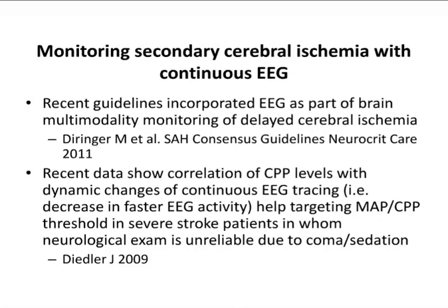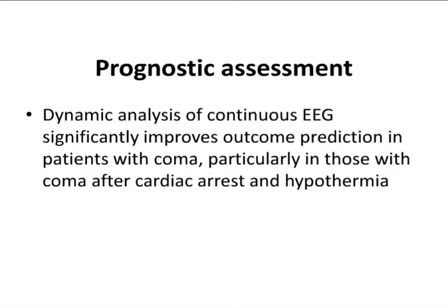And in terms of prognosis, another important issue is that we tend to see EEG just as a snapshot. And so you see seizures or not. You see theta activity, you see epileptiform patterns.